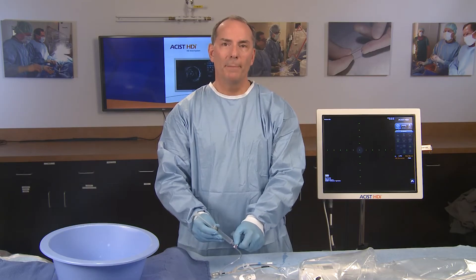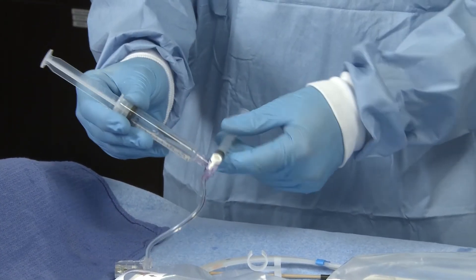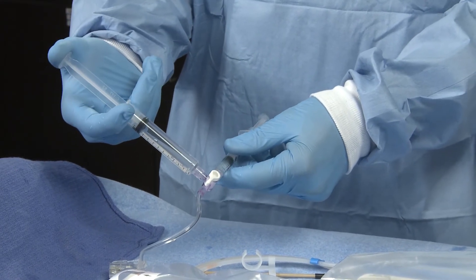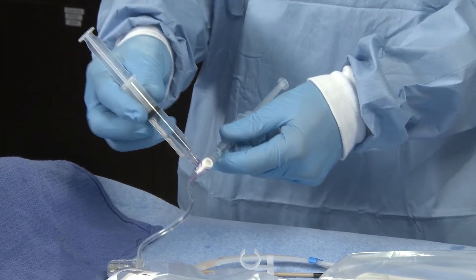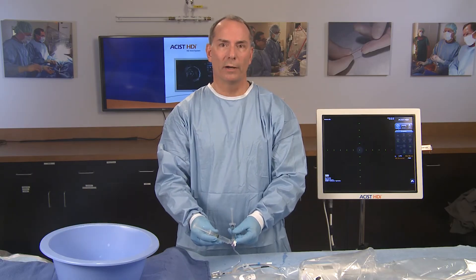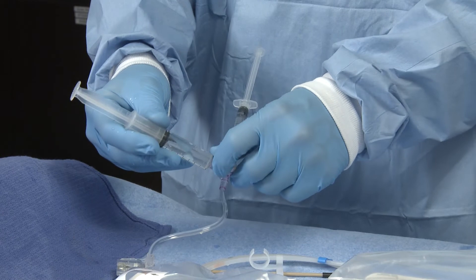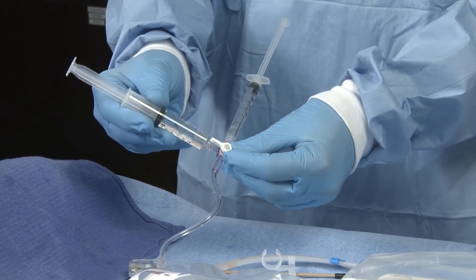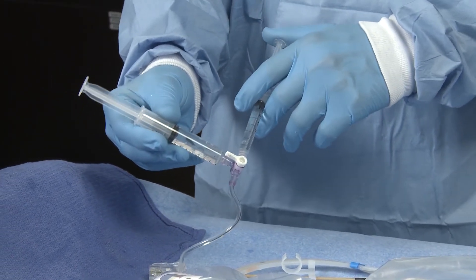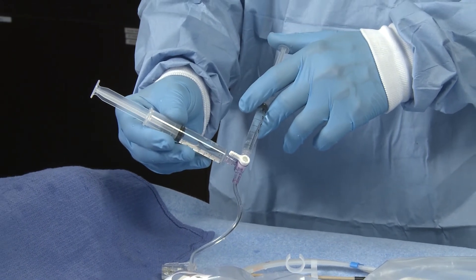Rotate the stopcock on the extension set and fill the 3 milliliter syringe from the 10 milliliter syringe. The 10 milliliter syringe is used as a reservoir for refilling the 3 milliliter syringe. Rotate the stopcock so the 3 milliliter syringe is set to introduce anticoagulant saline into the catheter.